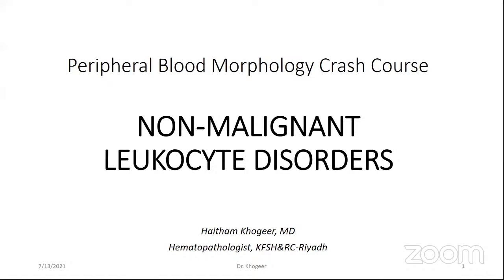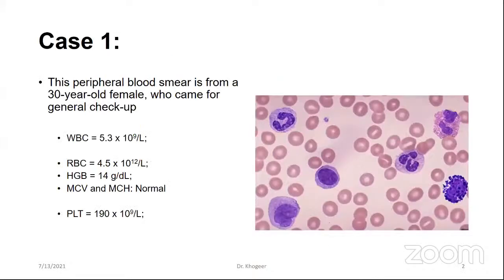Good evening, everyone. In this presentation, I will talk about the different non-malignant leukocyte disorders, in other words, benign white blood cell disorders. I will try my best to summarize and make it simple for you. So let us start with case number 1. This is a peripheral blood smear from a 30-year-old female who came for a general checkup.